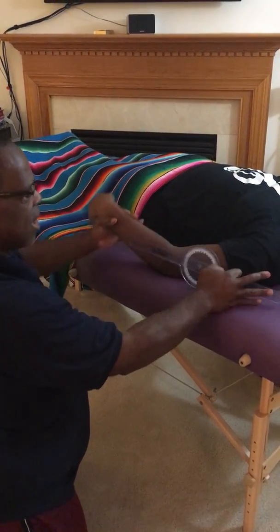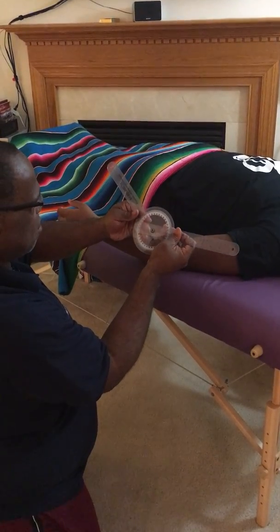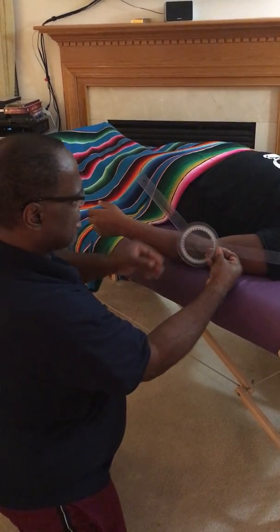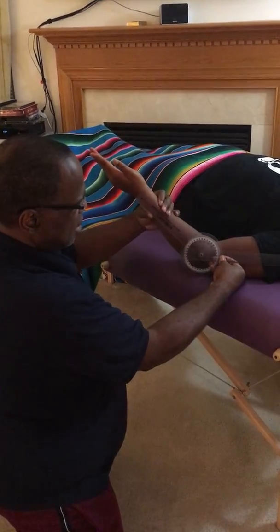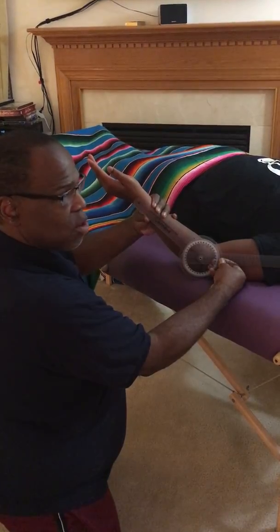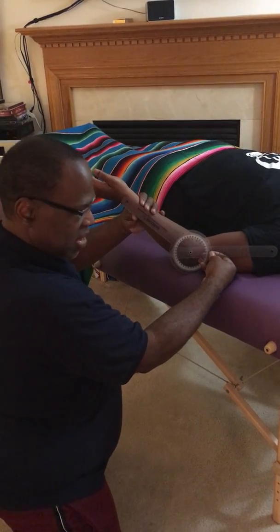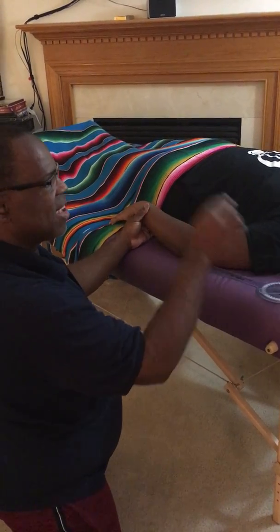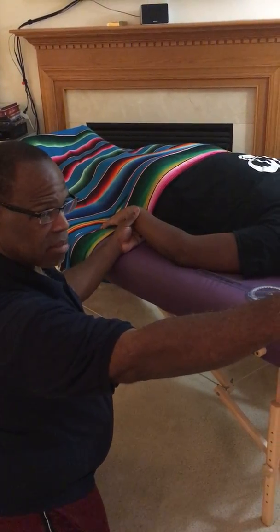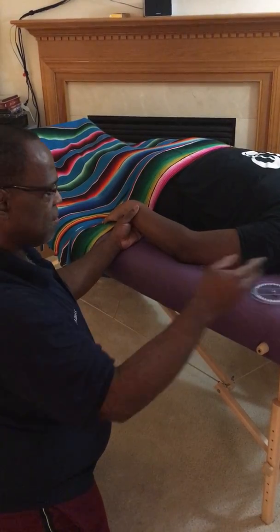Now, if we're looking at the number for extension, if she was sitting at, and we'll say the 40 again, we'll put it right back at the 40. All right, so there's 20, 30, 40. So we'll say that this is where she is. If she's sitting at 40 degrees, and she cannot go any further, and we say, what is her extension? That is her extension. Then the number for extension would be written as negative 40 degrees elbow extension. Again, it will be written as negative 40 degrees elbow extension.